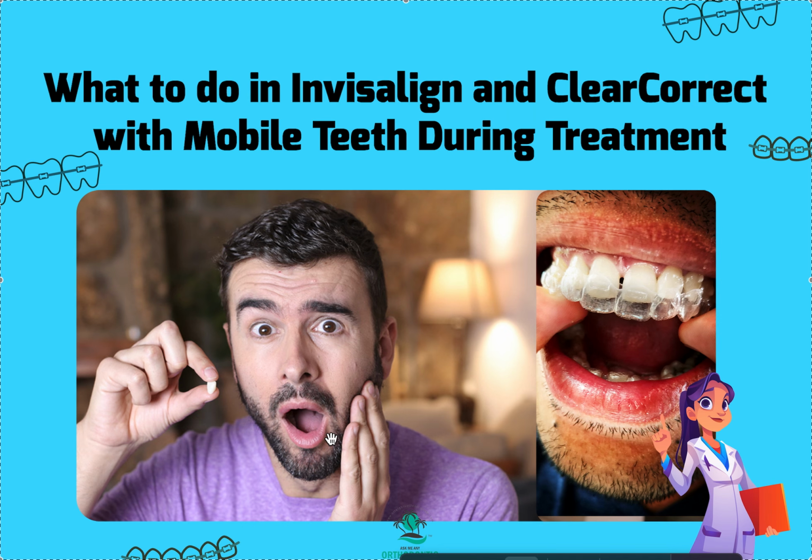This is part of the reason I always do perio patients with Invisalign, because A, they're very gracious about slowing things down, and B, their trim and their movements are a little bit slower, a little more gentle, and a little more healthy. The more aggressive you are and the more you're torquing those teeth, if you have a high trim line trying to take it off, the more likely you're going to get mobility. And that's just a fact check. I don't know if there's research to back that up, but that's a fact check. So, just things to keep in mind.